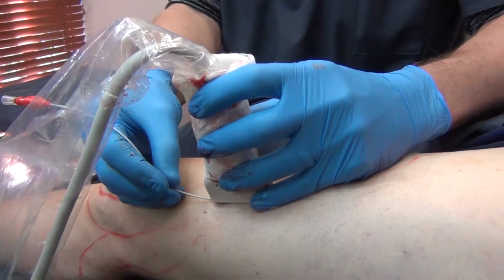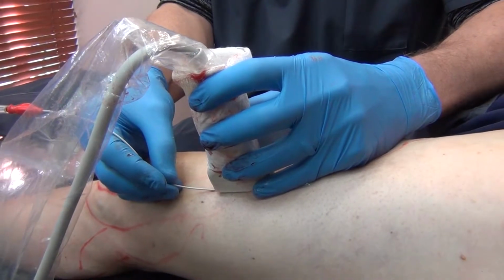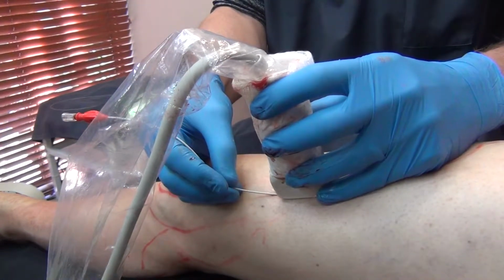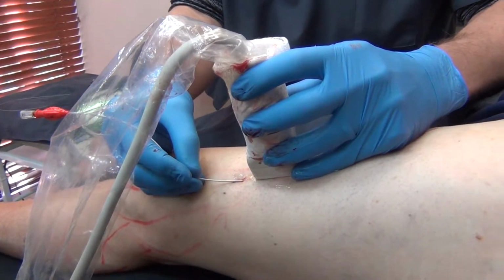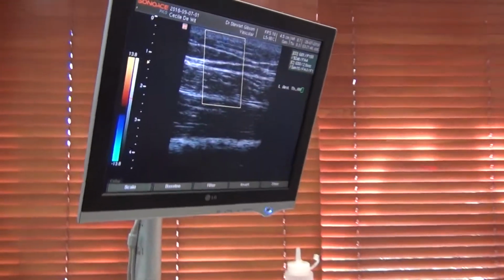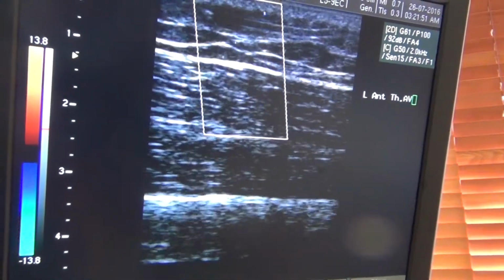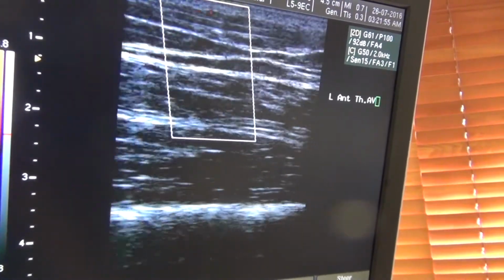I'm going to demonstrate that we now have, by way of the Seldinger technique, our 7 French catheter, and we're examining to see that the catheter is in fact in the vein, which we can see on the ultrasound, and you'll see the typical double lumen of a catheter, and we've gone directly through the anomalous component at the moment.